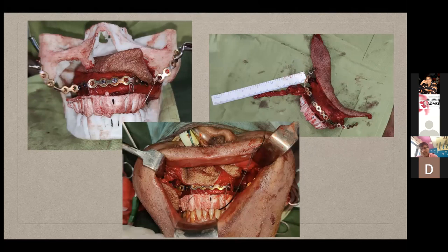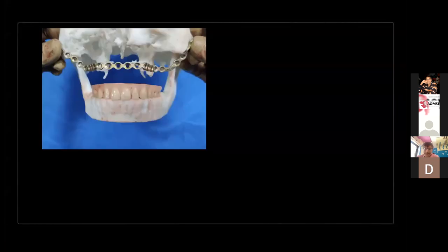Then we passively adapted the plate over the zygoma to fix screws. And once that was done, the maxilla along with the fibula was taken intraorally, IMF and fixation were done. So in following cases, we've started fabricating a denture with the help of a prosthodontist. He is arbitrarily fabricating a denture, and the denture is used as a guide for implant placement.